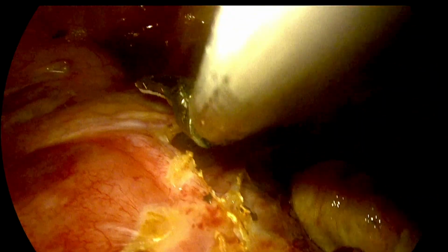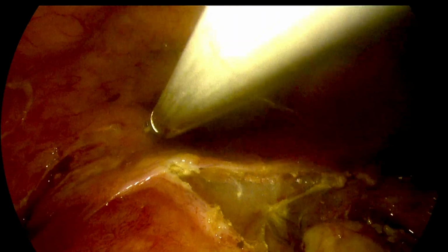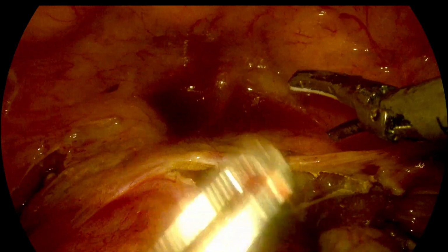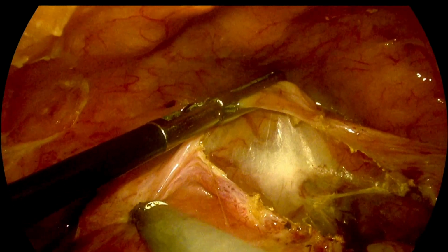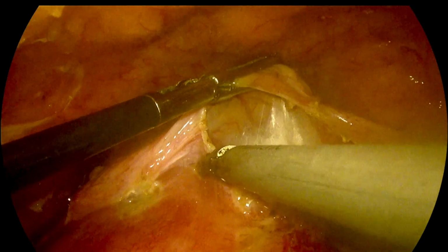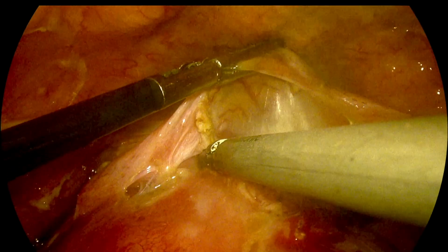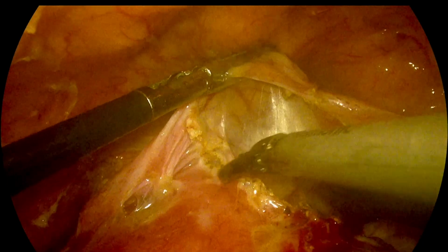Now we are trying to open the uterovesical fold of peritoneum, trying to separate the bladder from the cervix. So now we can see some amount of loose cellular tissue which is being identified, and we are trying to separate the uterovesical fold of peritoneum away from the cervix so that we can complete the process of hysterectomy. You can see loose cellular tissue is present.